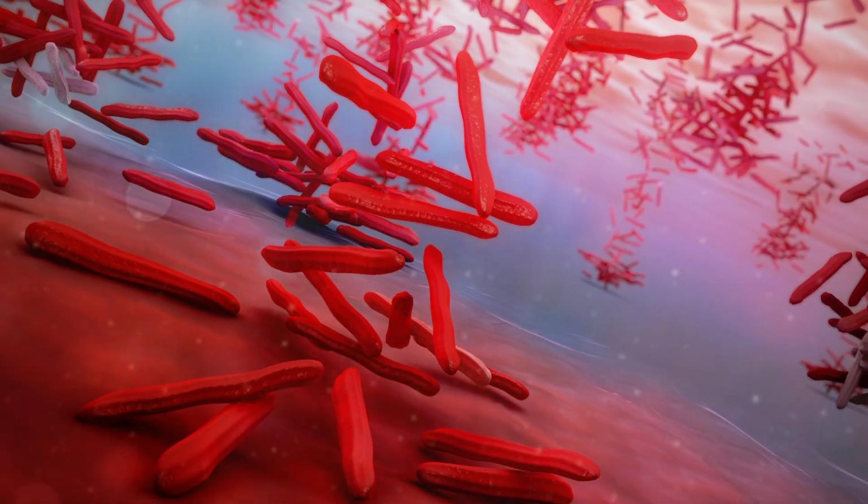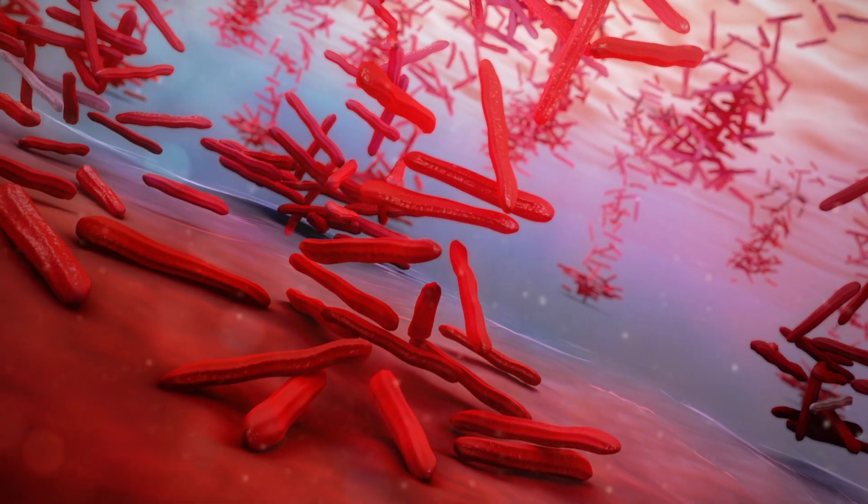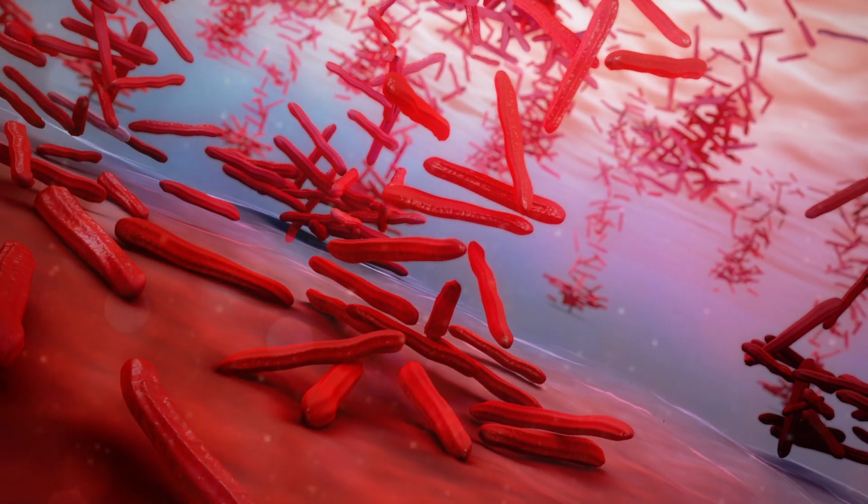Larger aggregates sink faster, reaching the bleeding tissue site before breaking apart completely, while smaller aggregates sink more slowly and break up as they descend. This process distributes ORC fragments throughout the blood and delivers ORC onto the bleeding site.